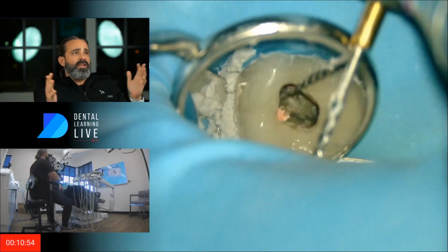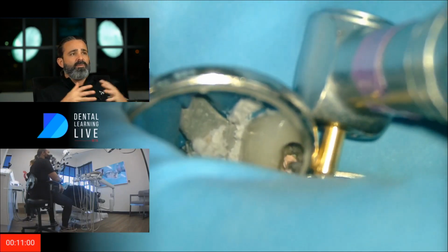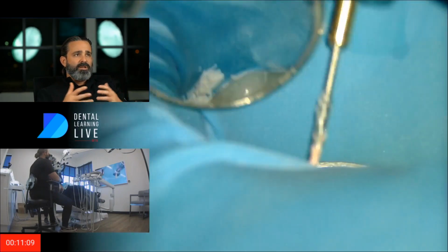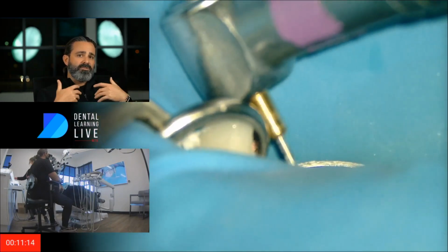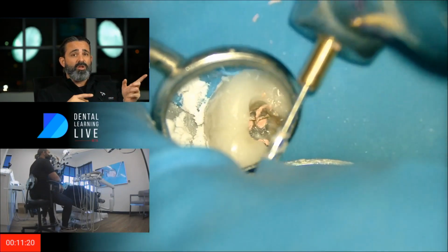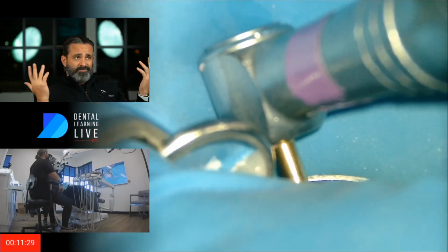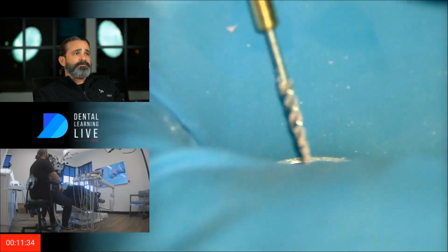It keeps me inside the canal and ensures that the gutta percha is softer than the dentinal wall, and so I can follow a pathway. And that's just kind of the way I do it. Sometimes too, if you use frictional heat and you're really pushing on the gutta percha, I find that you can actually get heavy-handed, especially towards the end or the apices, the radix of the tooth, and push things out or go long. And if you're wanting to use the GentleWave and you go long, that may pose a problem on your ability to use it in certain circumstances. And so I pay attention to that. Now, in the coronal third, you can be heavy-handed in it if you're comfortable with that. That's okay.